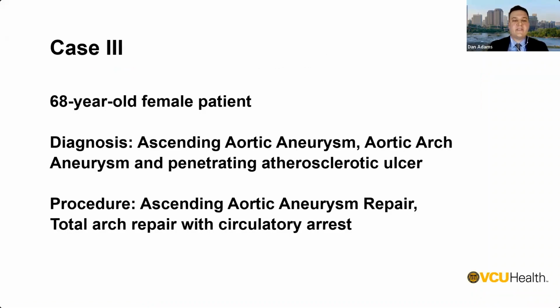Our next case is a 68-year-old female patient with a diagnosis of ascending aortic aneurysm, aortic arch aneurysm, and penetrating atherosclerotic ulcer. The procedure performed by Dr. Kasarajan was an ascending aortic aneurysm repair and total arch repair under deep hypothermic circulatory arrest. We presented this same case last year in November of 22 to explain how TCD technology can be used intraoperatively to navigate antegrade selective cerebral perfusion and deep hypothermic circulatory arrest.